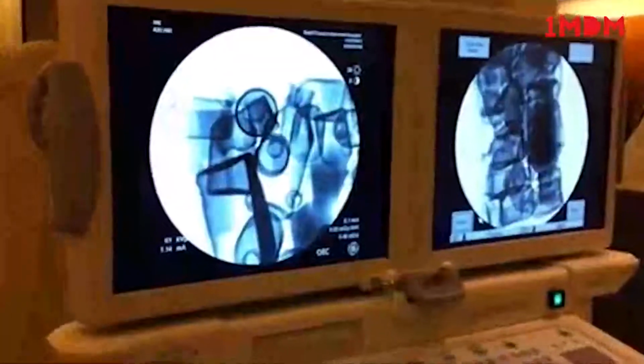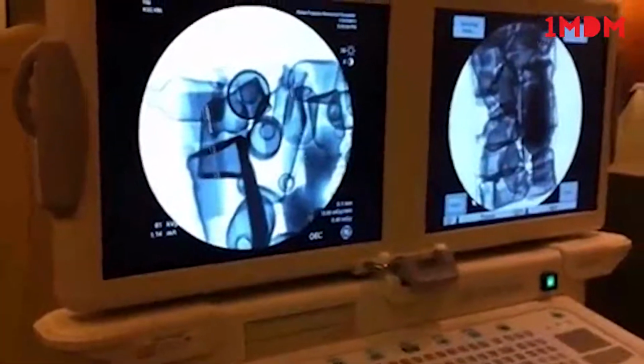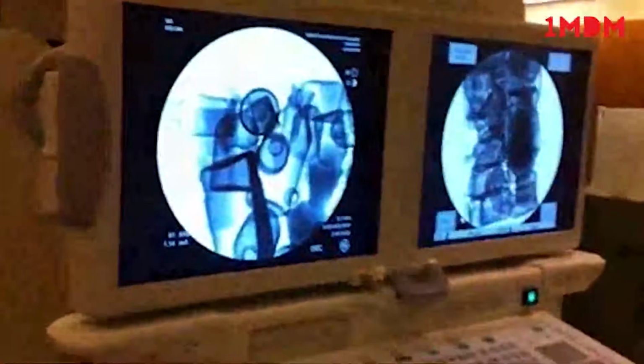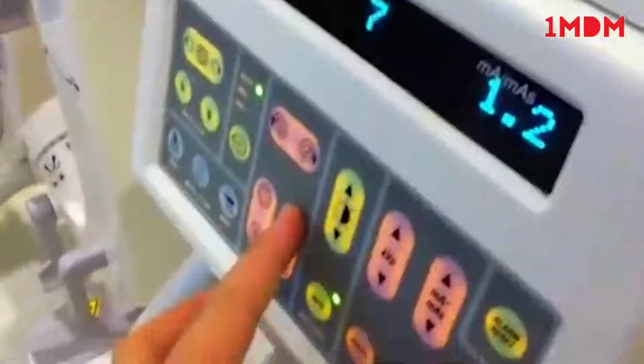And the next one here. I don't know if you can see those two little lines coming together now. You can use this orientation tool to change your side collimators. These are basically the side shutters. There you go, and that's how you collimate. Let's reset the collimation and open it back up.